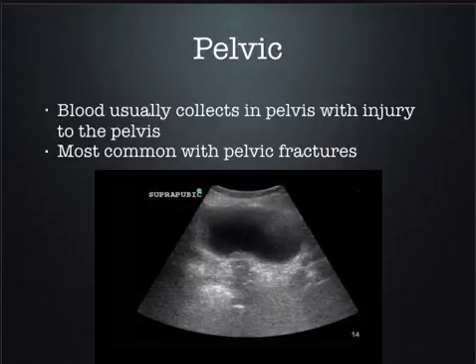All right, the pelvis is a little different. We like the pelvis because we got this nice window, so we have this black fluid. So anytime you see the wall of the bladder outlined, as we do here, you can see the wall, that's abnormal. This is actually an ovarian cyst. Over here, it's contained. This fluid is contained. That's why it's nice and round. And it's bleeding. So this is fluid in the pelvis or blood in the pelvis, and it's from this ovarian cyst. That's free fluid in the pelvis.